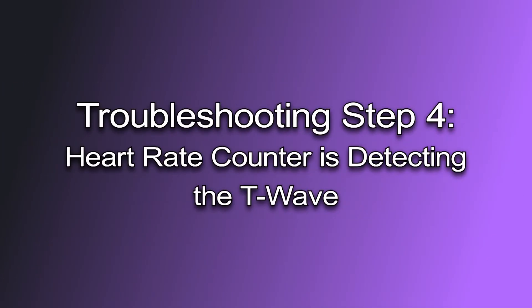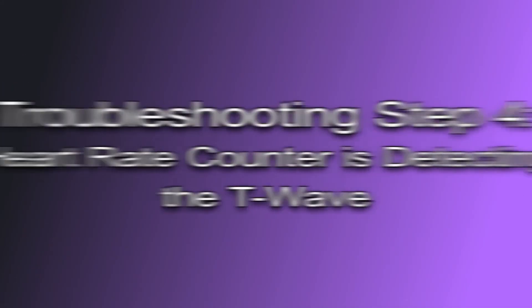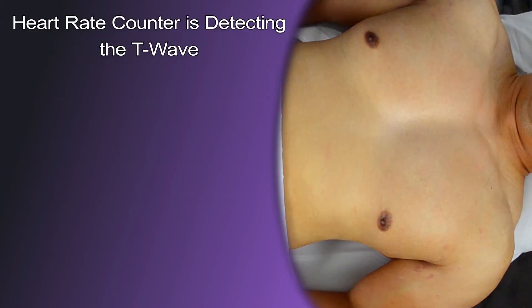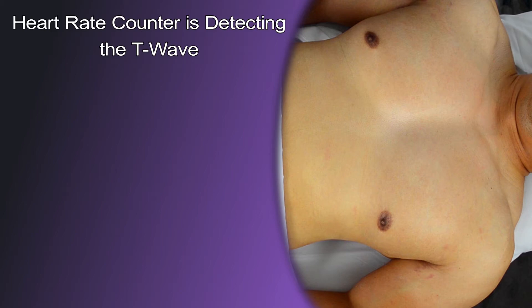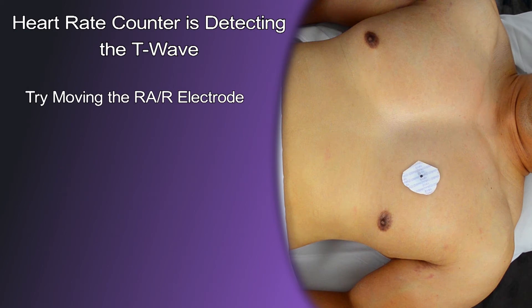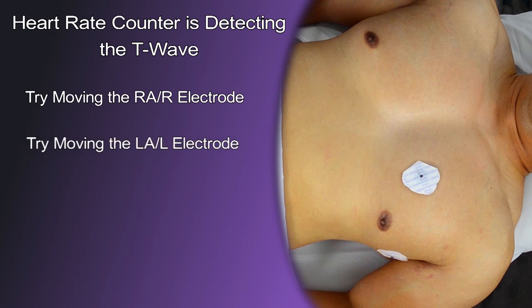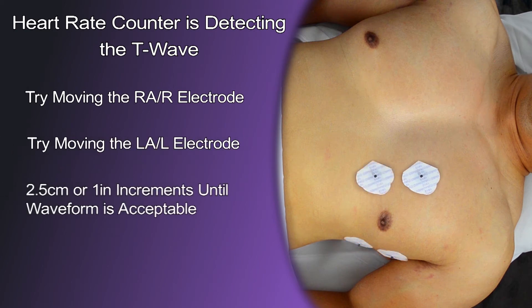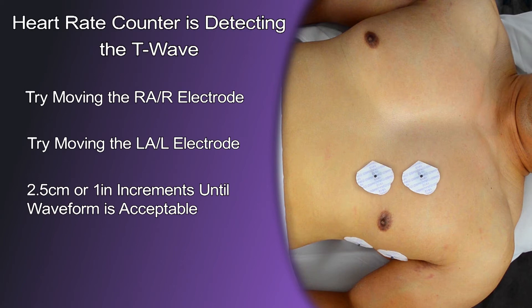Troubleshooting Step 4: Heart rate counter is detecting T wave. When blood flow artifact is represented in an elevated T wave due to the MHD effect when a patient is inside the MRI bore, try moving the RA or R and LA or L electrodes down the rib cage in 2.5 centimeter (1 inch) increments until the waveform is acceptable.